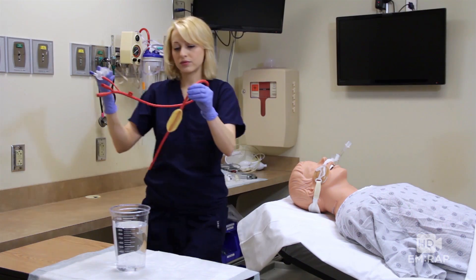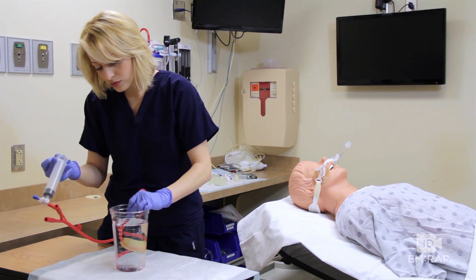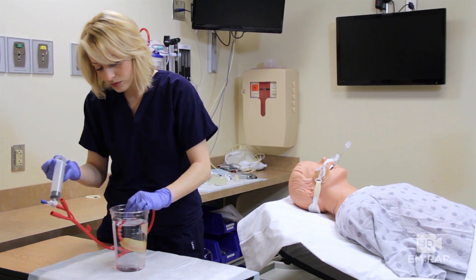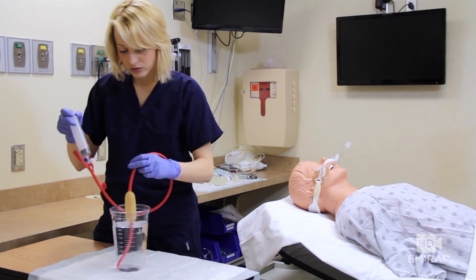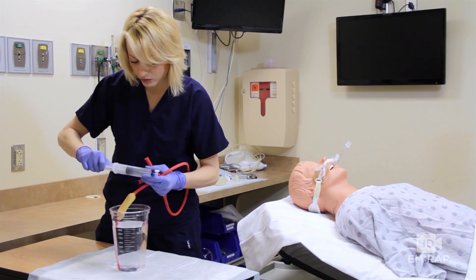Now we're going to check to make sure there's no leaks in the balloon — it's ill-timed if you discover that when it's in the patient. So inflate some air and make sure no bubbles come out of it. And now fully deflate the balloon. It's a lot easier to insert it if the balloon is deflated.